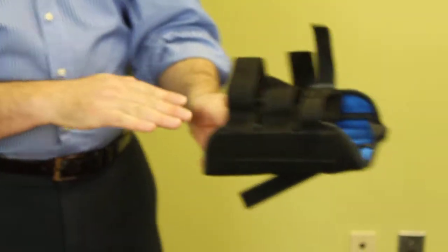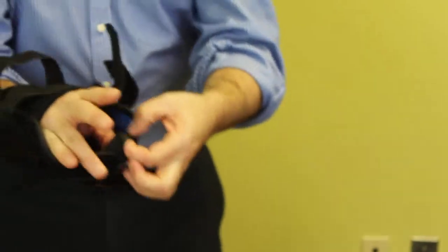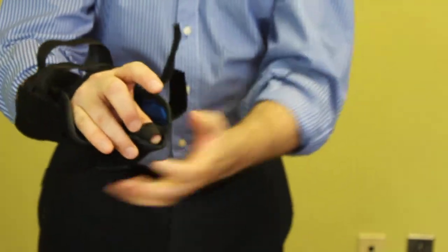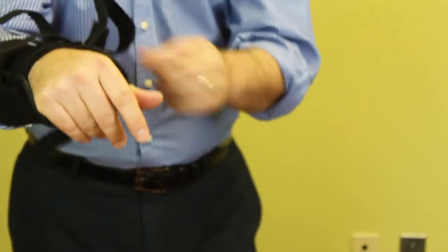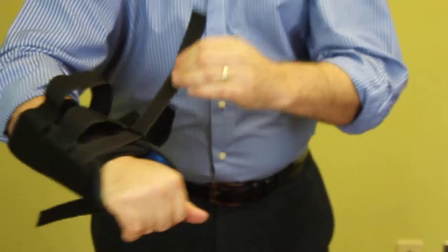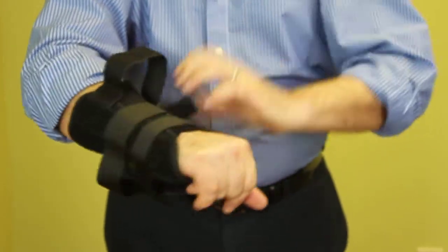All you need to do is slide your hand through the device, and you will have a little strap here that you would slide your thumb into. Once it's on and set, then you would just take the Velcro straps and just tighten them around your wrist, like this.